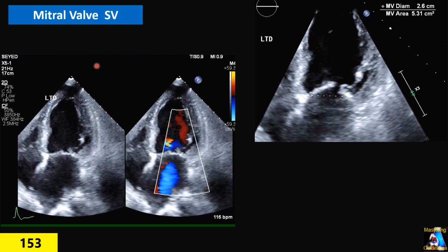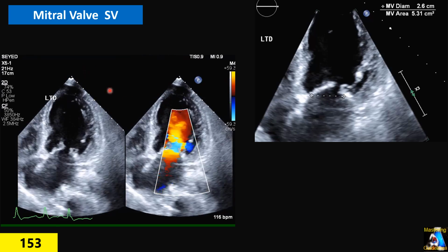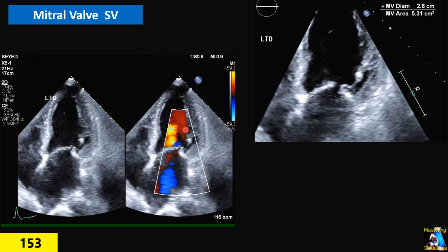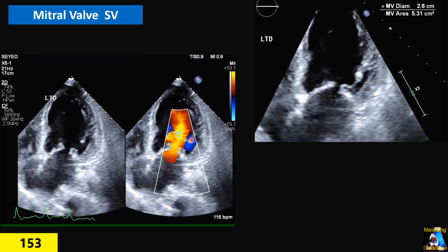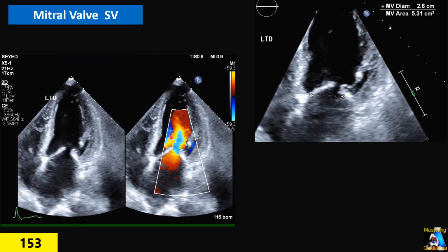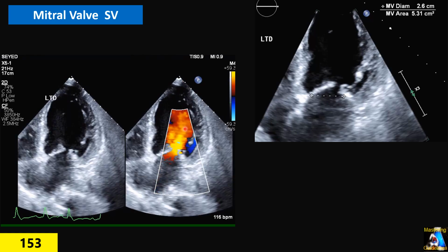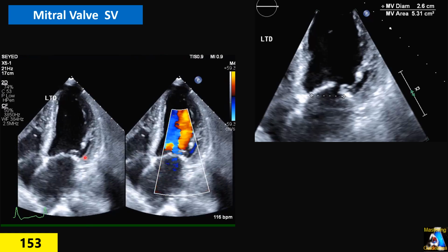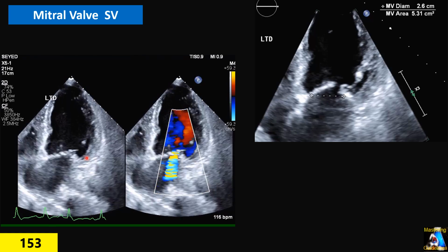For mitral valve stroke volume, or mitral valve inflow rate, we go apical 4 and put the color on the mitral valve to determine the direction of the inflow jet, because it's the same principle. For any kind of Doppler, we have to make our cursor parallel to the blood flow at that spot. So when you do apical and then zoom on it with cine loop, find the hinge of the mitral valve, or annulus of the mitral valve.